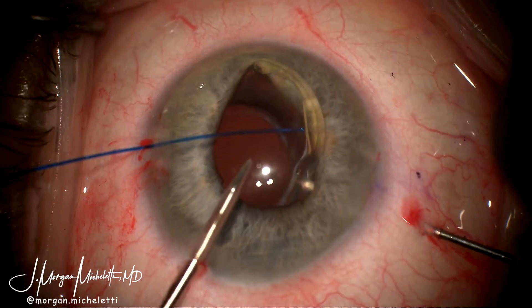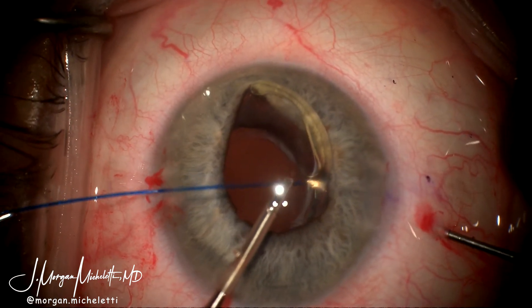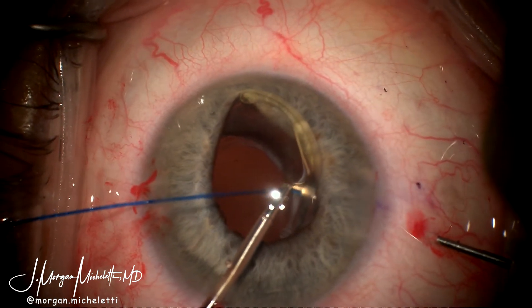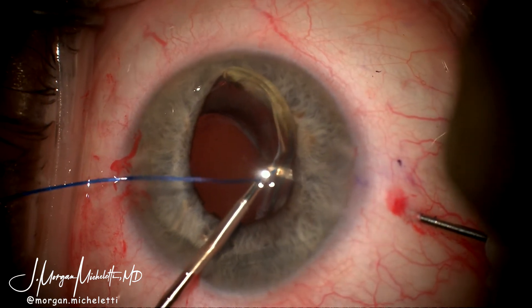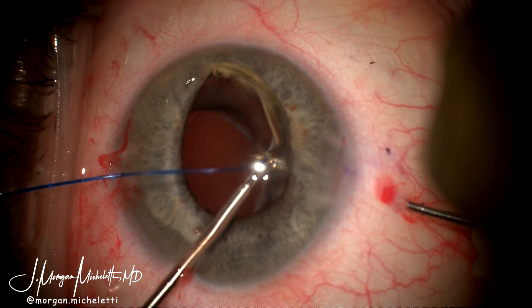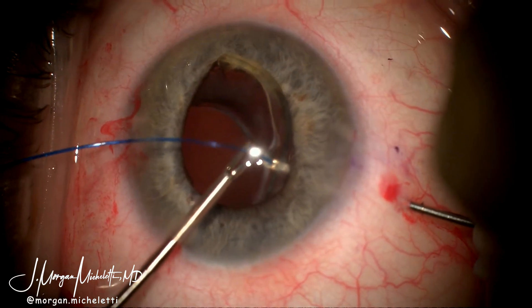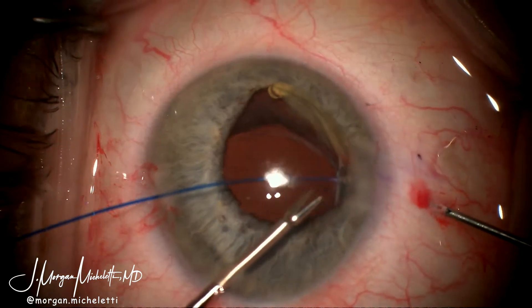A 5.0 Prolene suture is then threaded through the superior paracentesis, and if you note the 27-gauge needle is located inferiorly, which is where the wound had initially been created as well. I'm using a micro-grasper forcep to thread the 5.0 Prolene through the newly created hole in the haptic-optic junction, and handshake or dock that Prolene with the 27-gauge needle.